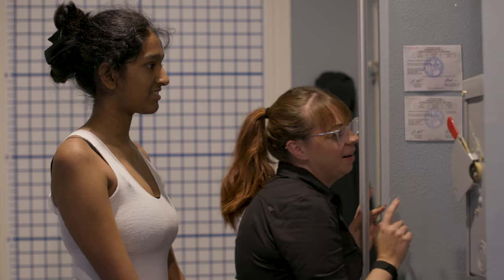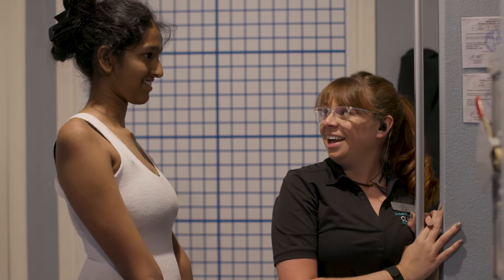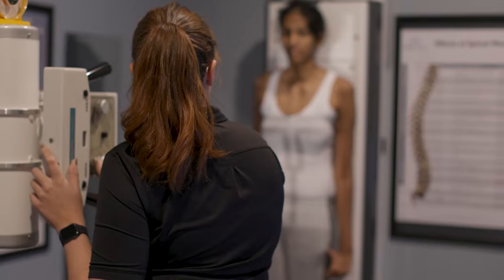Some patients tend to be concerned about the effect x-ray radiation can have. The good thing about Scoliosis Reduction Center is that we have the latest digital scoliosis x-ray technology, which minimizes radiation exposure. The time it takes to take the x-ray is directly related to how much exposure you receive — the faster the x-ray machine, the less exposure. When I first started practicing, a full set of x-rays could require three to four seconds of exposure; these days it's measured in milliseconds.